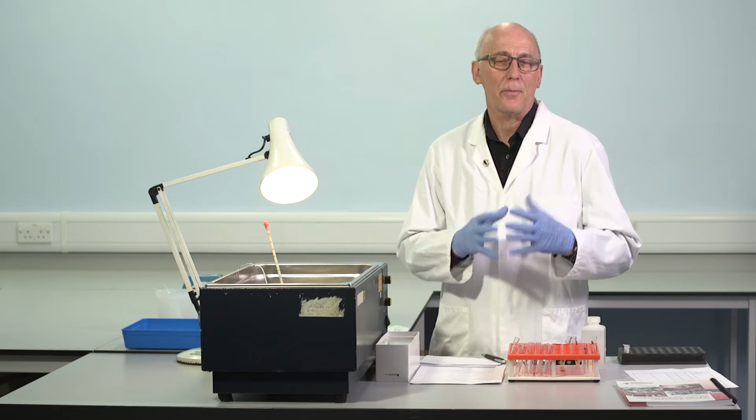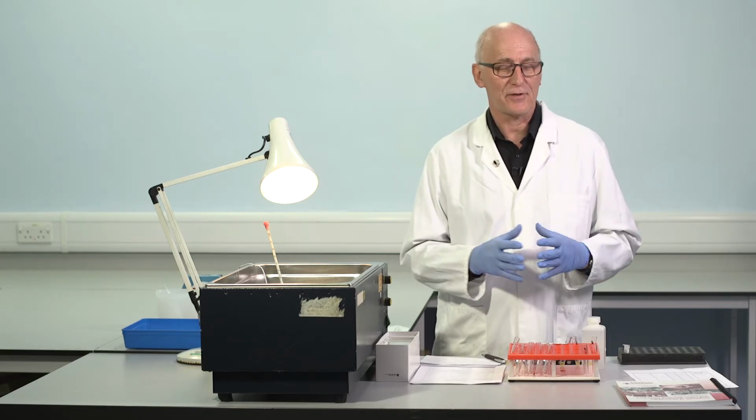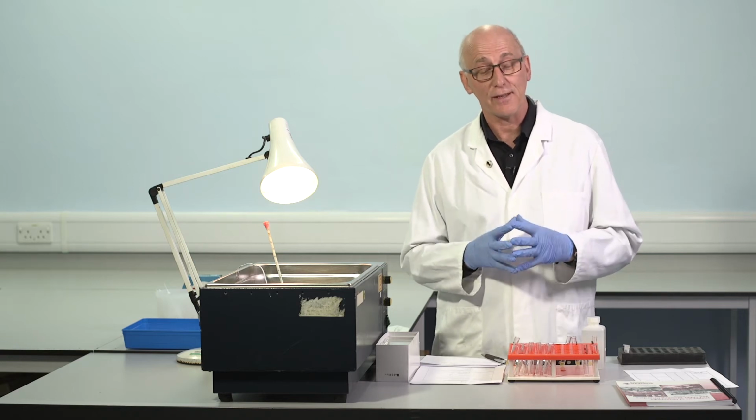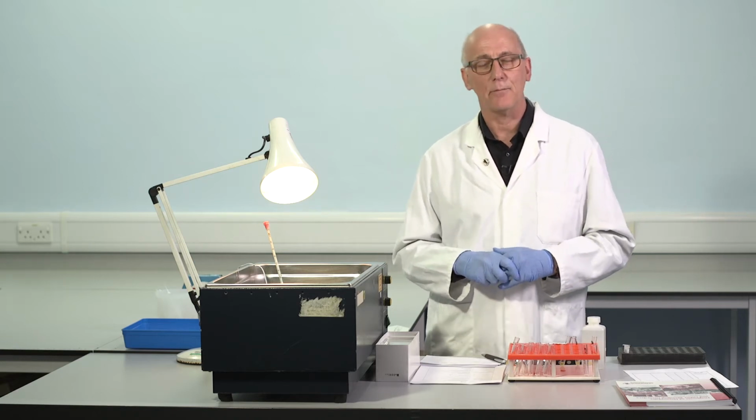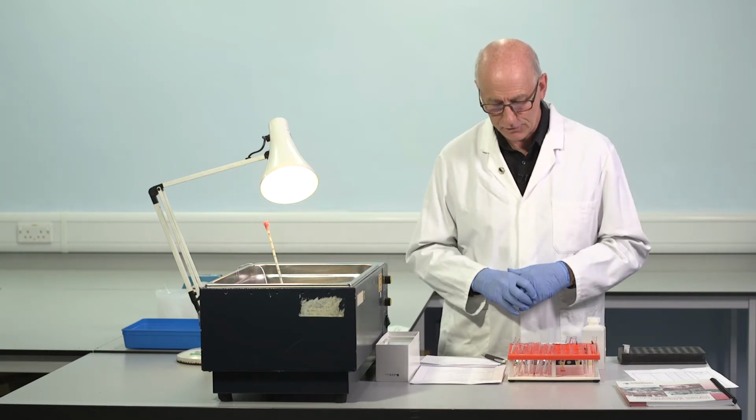Otherwise, a person might assume that the test has been done really in percentage against pooled normal plasma, and that's not the case if the standard is calibrated in international units. So I think it's important not to be lazy in the terminology.